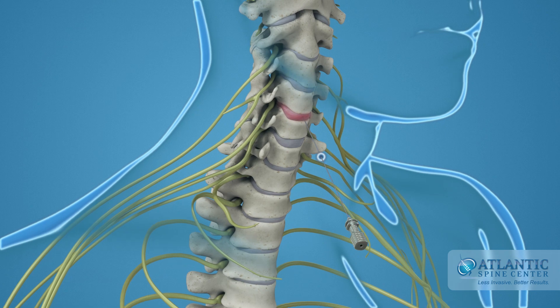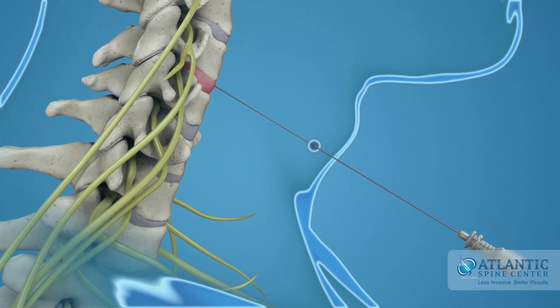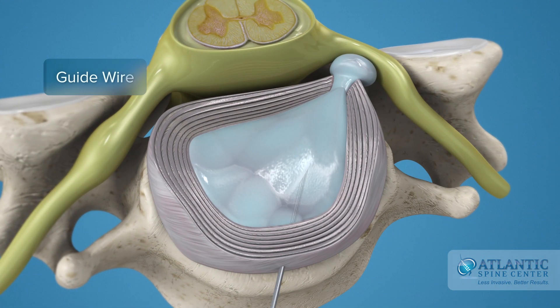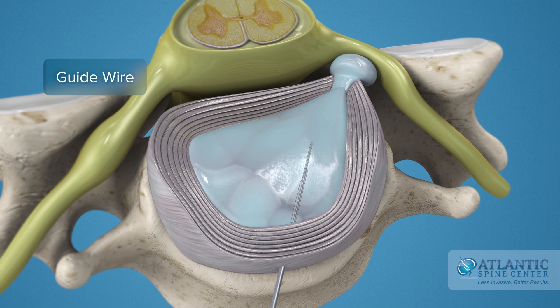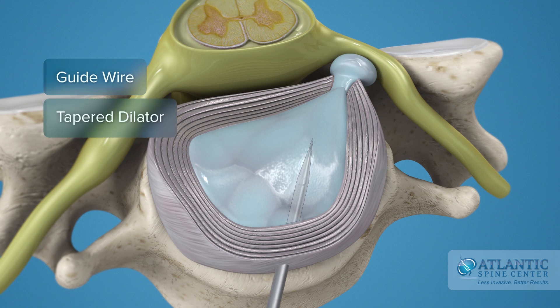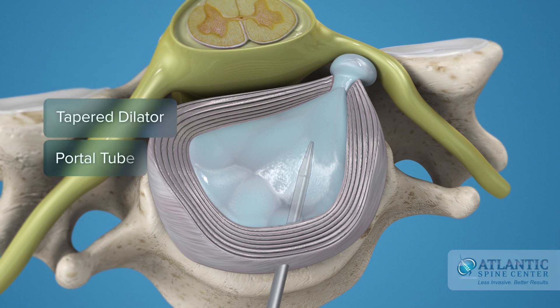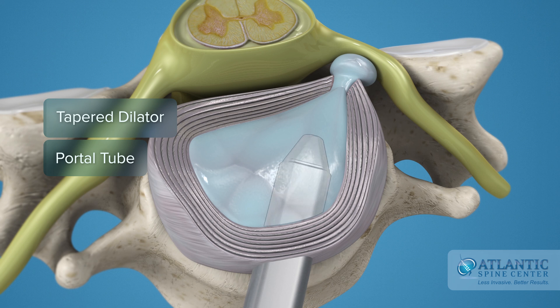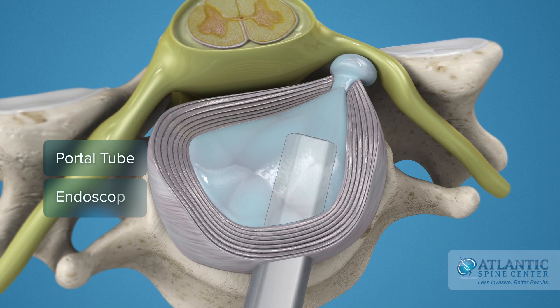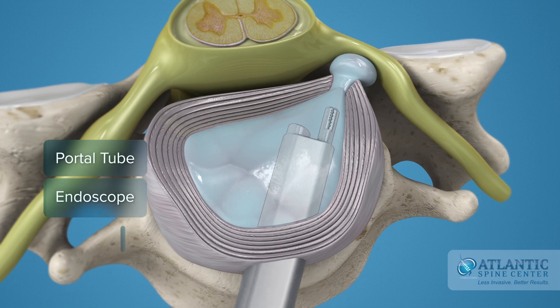First, a thin needle is placed under x-ray control down to the involved disc level. Then, a guide wire is placed through the needle, and a dilator is inserted over the guide wire. Next, a working tube is inserted to the targeted disc herniation. Finally, the spinal endoscope is placed through the working tube.